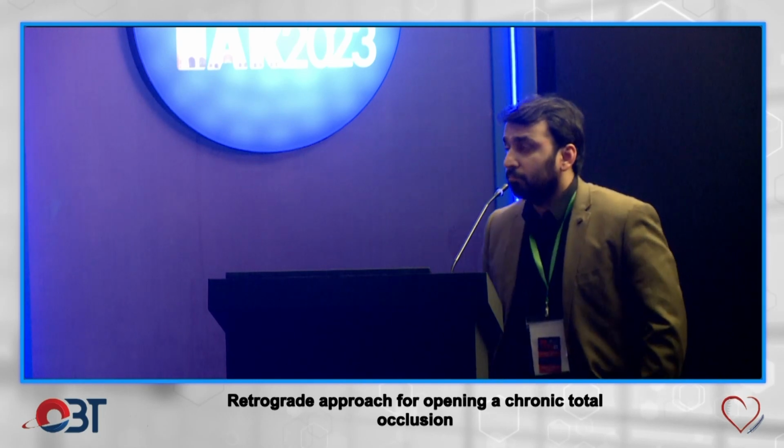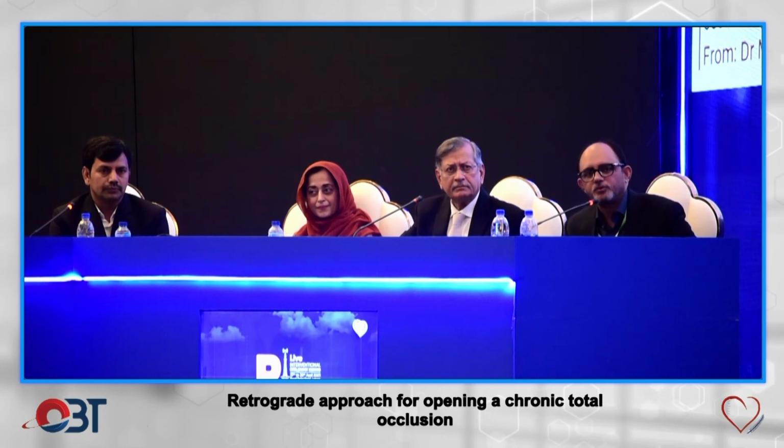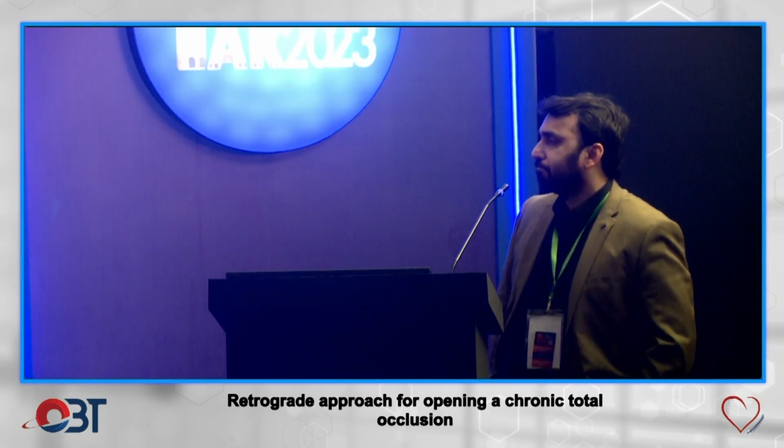It's always good to have a protection wire in the donor vessel because if anything goes wrong there, then you should have a wire in that vessel. A protection wire. Yes, you're right.